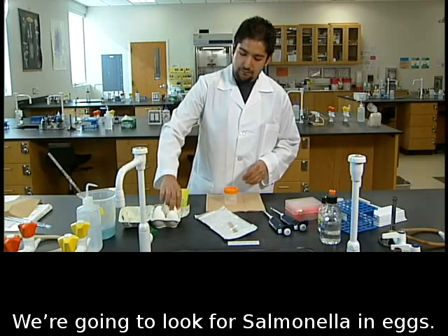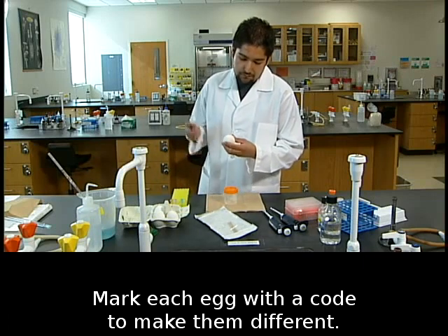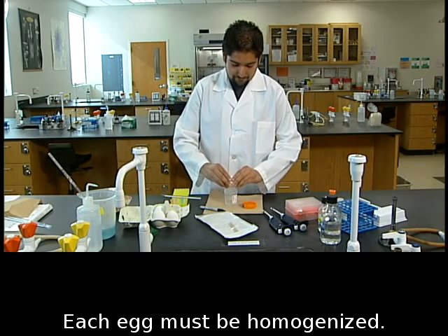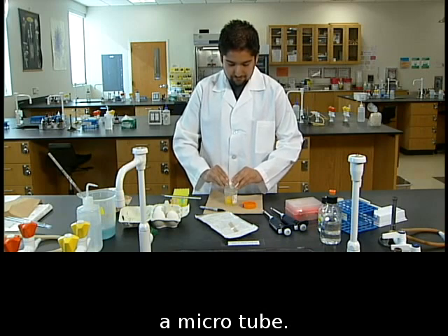We're going to look for salmonella in eggs. Mark each egg with a code to make them different. Each egg must be homogenized. Transfer a working sample of each egg to a microtube.